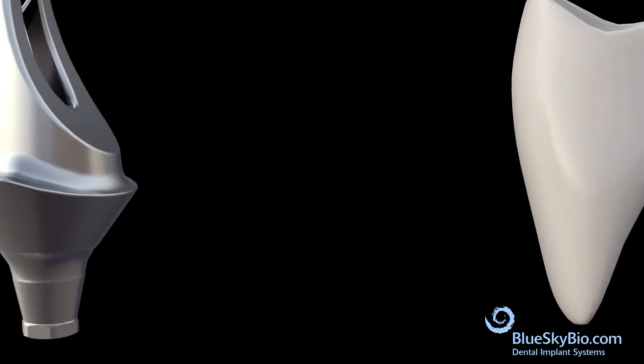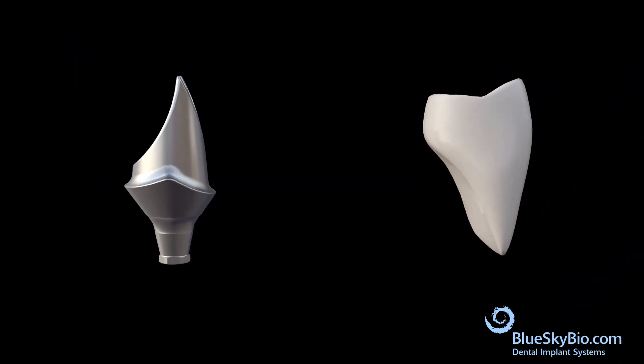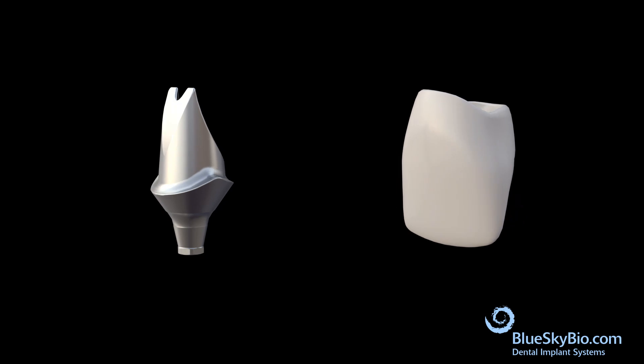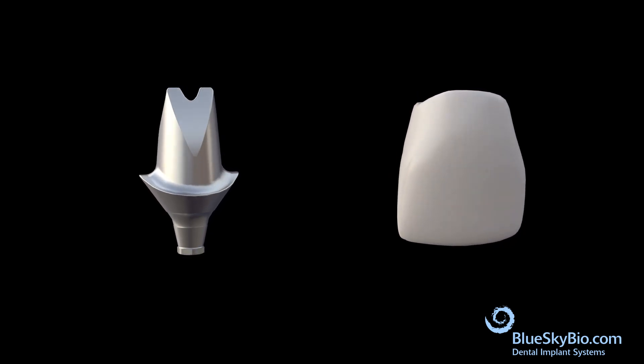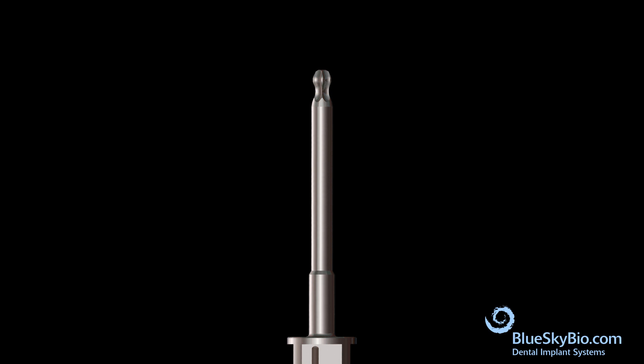This video shows how to make a custom abutment from a preformed blank and a screw retained restoration made from a self-supporting ceramic such as zirconia or disilicate. An angled ball tip screwdriver is utilized for fixation screw placement.